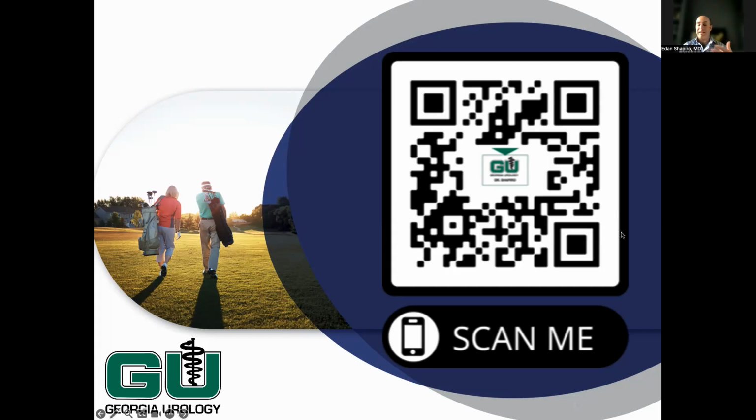If it does, that at least tells us it's the prostate. And we can look inside and we can do a urocuff, and we can say, is it that the prostate is just continuing to grow and the UroLift force of holding things open is no longer sufficient to do it, in which case we could do something else, or is there a different process taking place?